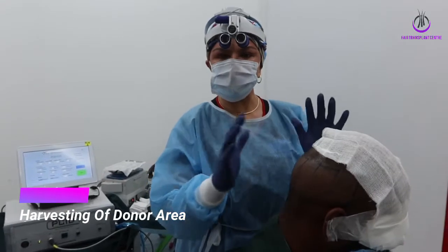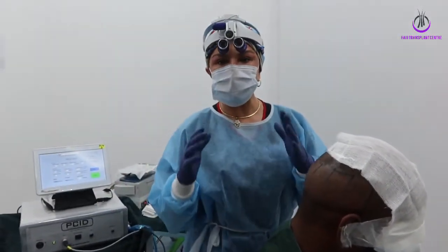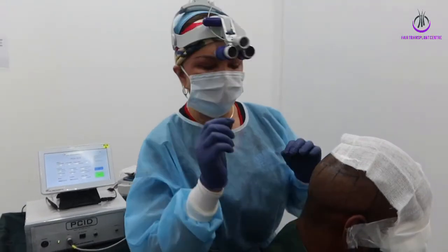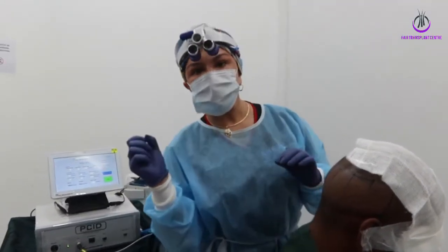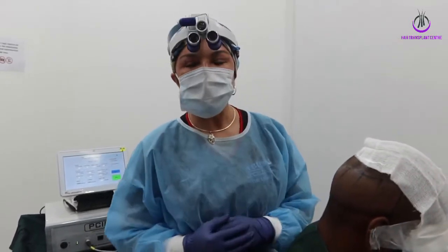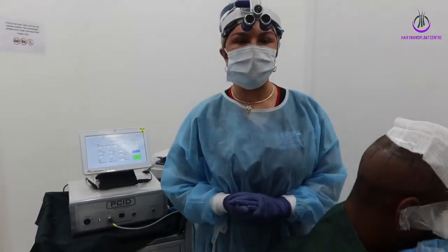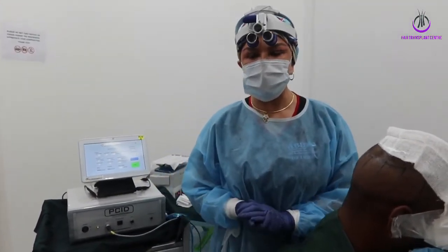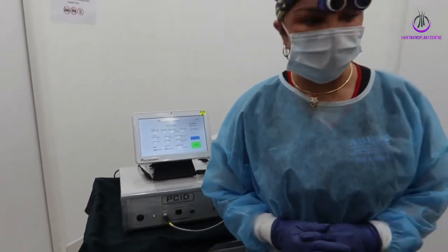So now the patient is ready for harvesting. What does harvesting mean? Basically, harvesting means that we are going to punch the grafts out. There are many ways of harvesting the grafts, depending on the individual clinic. They use different kinds of devices. Here at Hair Transplant Centre, we use the PCID machine to do the harvesting of the grafts.